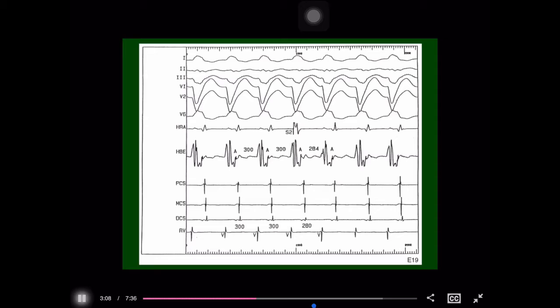And the issue is which type. It's a classic looking left bundle. So in a classic typical left bundle, the ventricle is activated over the right bundle. So if you make one other measurement, very important to make, if you look at the beginning of the QRS, you'll see that the RV apical area is activated right at the beginning of the QRS.